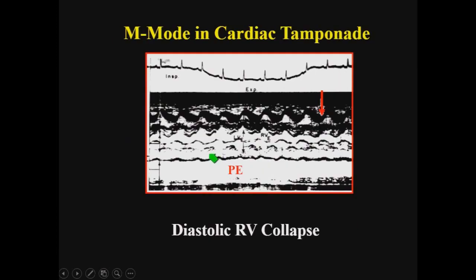So with this, I think that you have many more. This is what you see, for example, in a patient that has pericardial effusion, but I think that you want to hear Dr. Origema as well, and I will stop here. Thank you.